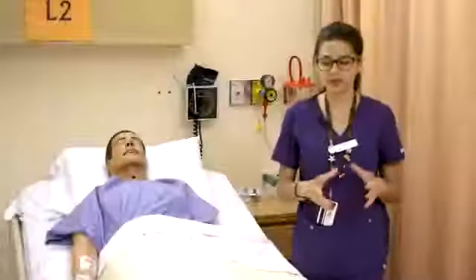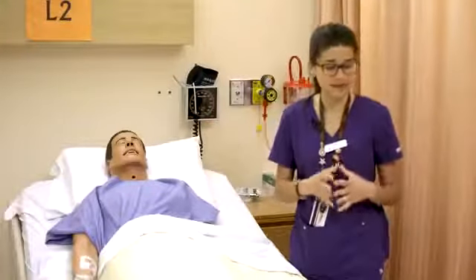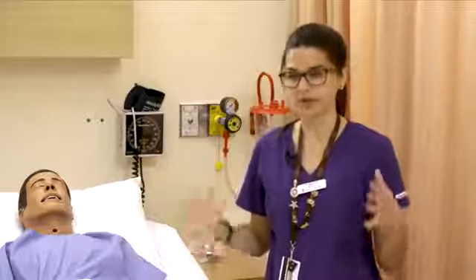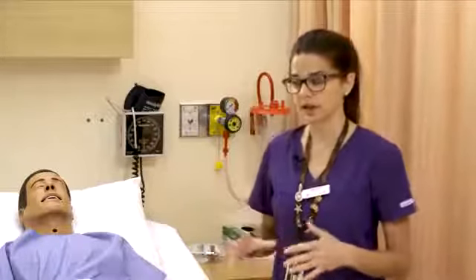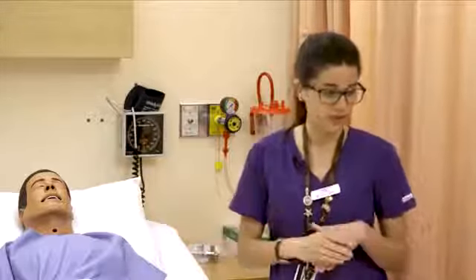So now we're going to go over the different oxygen delivery systems or methods. Before initiating oxygen, you do need to make sure that there is a physician's order for it. Most facilities have standing orders to cover critical or emergent situations where the person needs oxygen right away. So you just want to make sure you know your facility's policy and procedure on that, and or what the standing orders are for your patient.